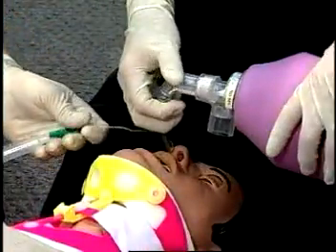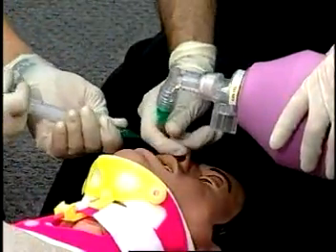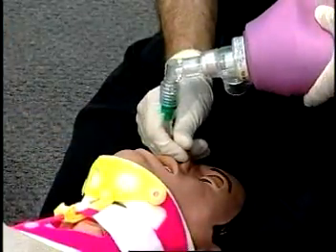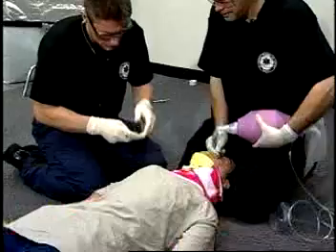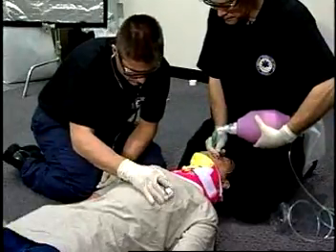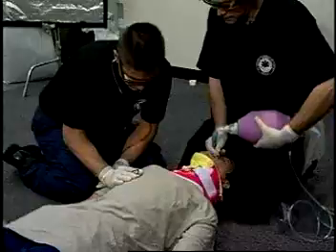Inflate the cuff, remove the syringe, and confirm proper placement by observing the chest rise, by feeling air exchange at the external end of the tube, and by auscultation of bilateral breath sounds over the mid-lung fields.